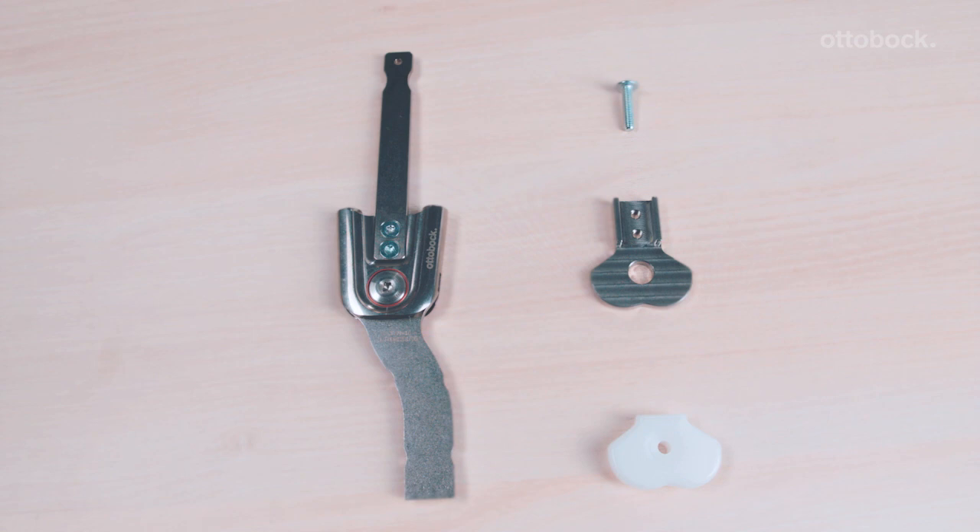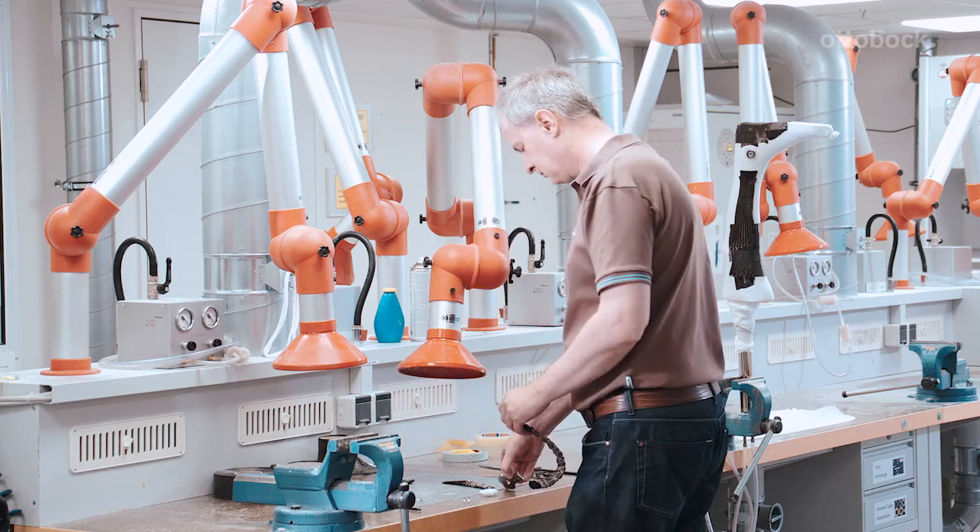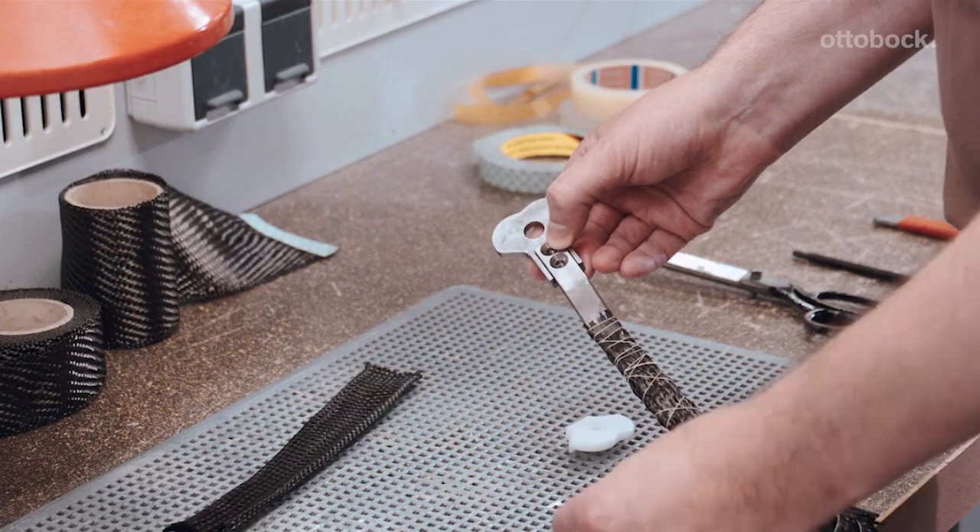The plastic dummy cover provides the necessary opening for the ankle joint in the foot component later on, and automatically positions the foot stirrup in the required neutral position.